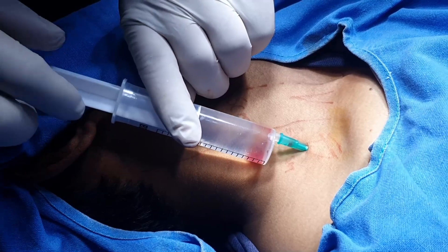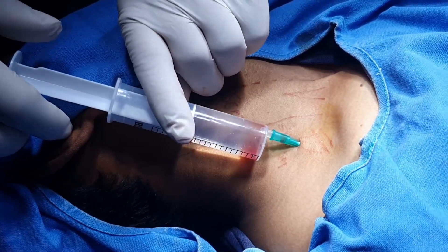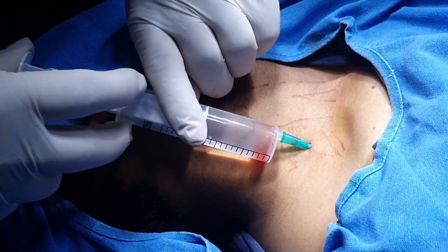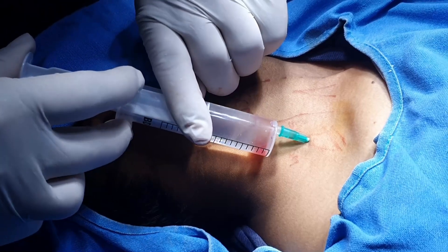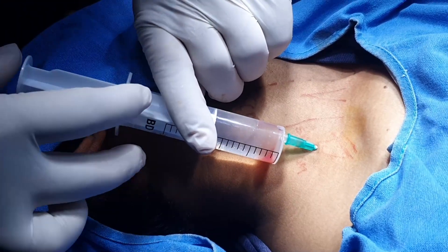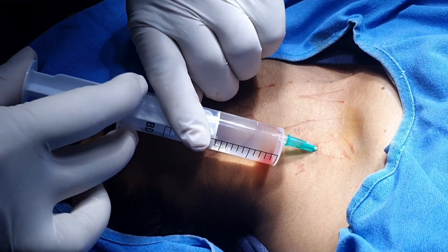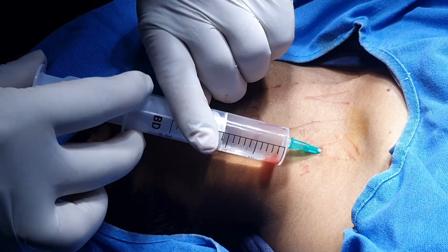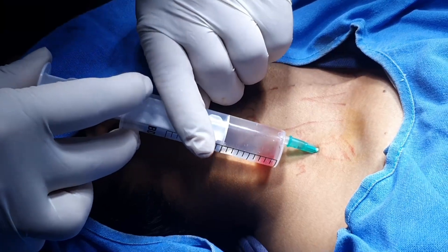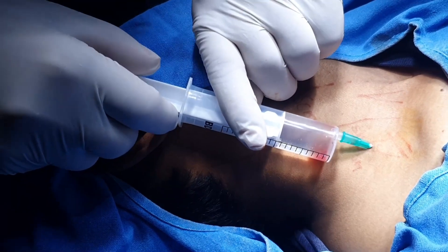Again rotate the syringe, inject, aspirate — and the pulse is stable, between 77 and 80. Again aspirate, again rotate, rotate, rotate, aspirate — aspirate — yeah, at the time of injection, continue to aspirate and rotate.